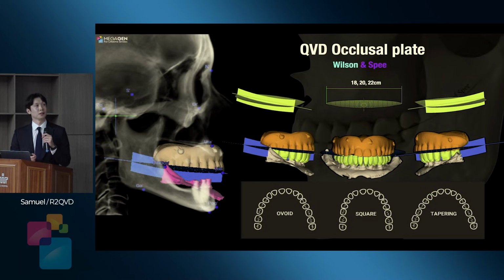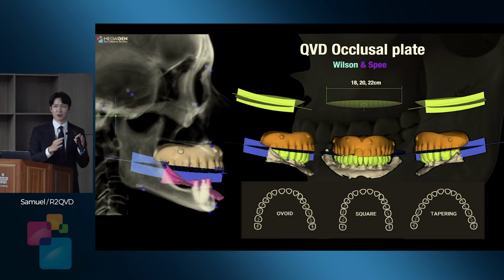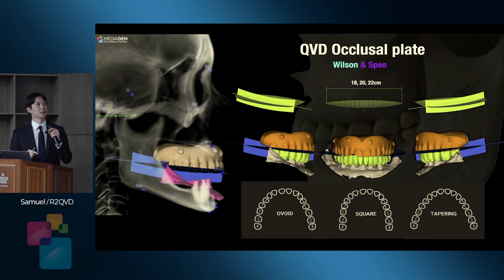Of course, using AI, it needs some changes, case by case. It's not perfect, it's only the ideal crown position. We have to change it with the patient's mouth. But anyway, with just some clicks with the AI, we can make a diagnostic wax-up ideally.